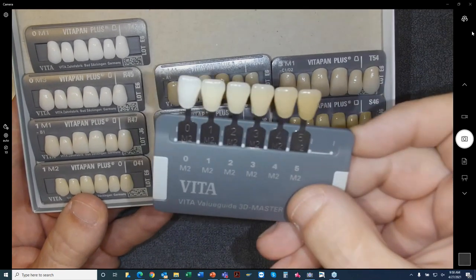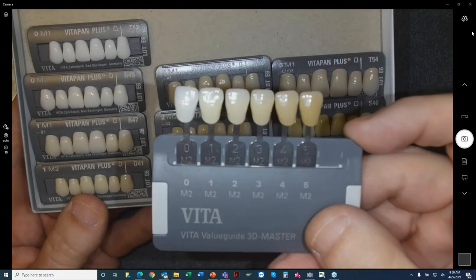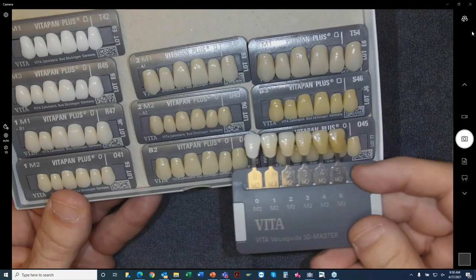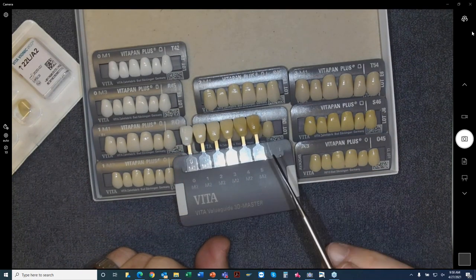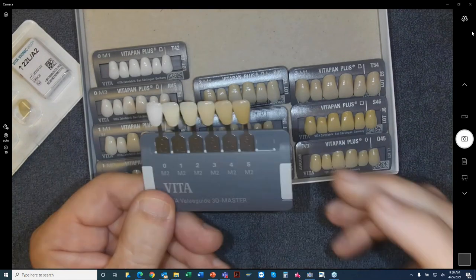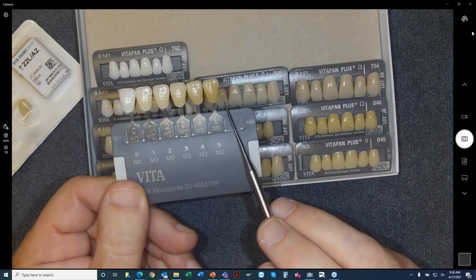They could also use another shade guide, something like this. This is a linear guide, and it's already controlled from a brightness all the way to a darker shade. So it is possible that your doctor every time would select one of these shades, and then you could use that.